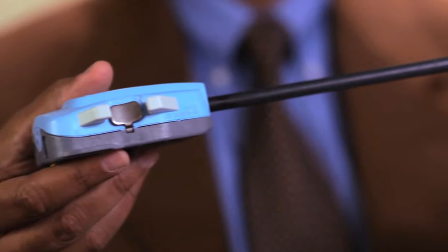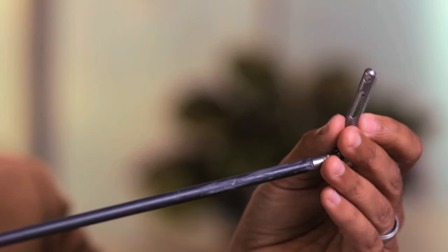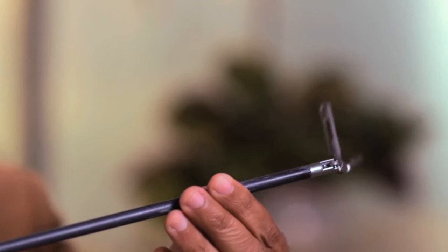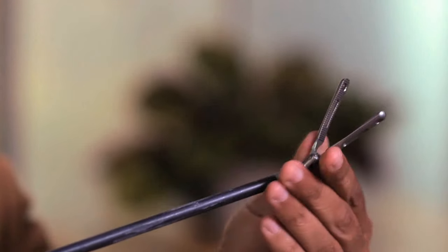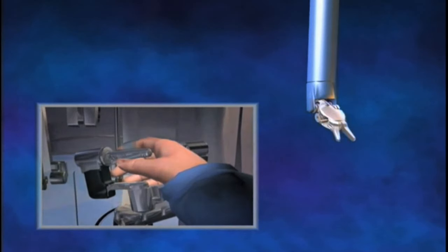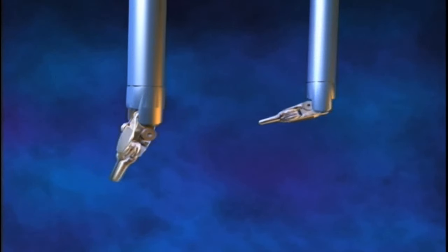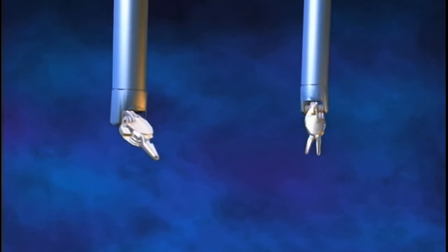This is one of the instruments that the surgeon controls sitting at the console. It's attached to one of the robot arms and placed into the abdomen. This particular instrument is a bowel grasper. It allows the surgeon to safely hold the colon, move it around the abdomen, and secure it in position to do the fine work needed. The tip of the instrument has several degrees of rotation, and the surgeon has control of that tip. It also is attached to electrocautery and allows for control of bleeding.